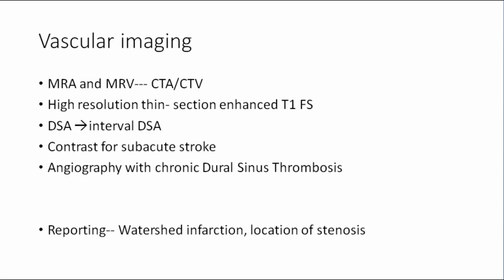Okay, coming to the vascular imaging. In these patients, we need MRA. If you suspect it's a venous stroke, then you need an MR venogram. And it does happen that you may not get the information you are looking for. So clinicians, physicians go by theory, by hypothesis. I'm thinking this is what it is, and it's not proven. Either I'm wrong or I need to look more. So you have to consider how strong your suspicion is.